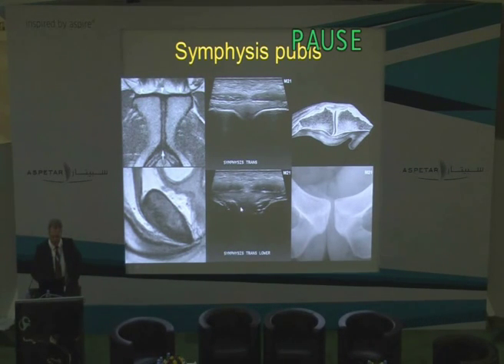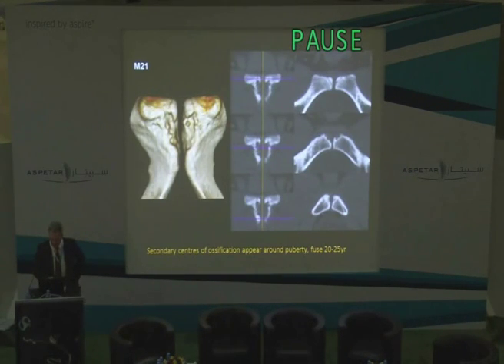Notice as well, as we come down lower on the joint, that we start to see the pubic apophyses on both sides, normal appearances. Looking at the pubic apophysis, which is resolved routinely on both MRI and ultrasound in athletes, often into their late 20s, because these individuals under high loading stress tend to have delayed maturation, delayed closure of their physis.